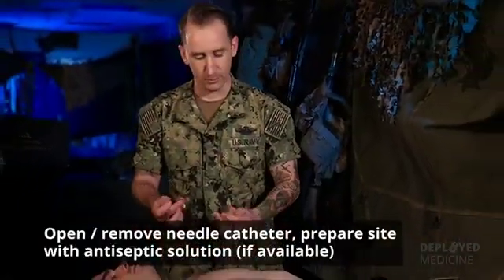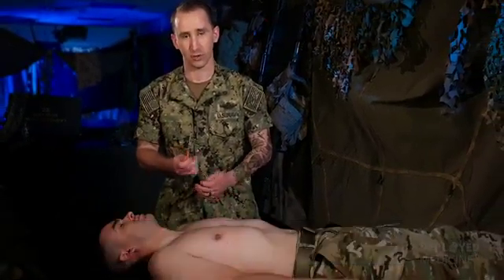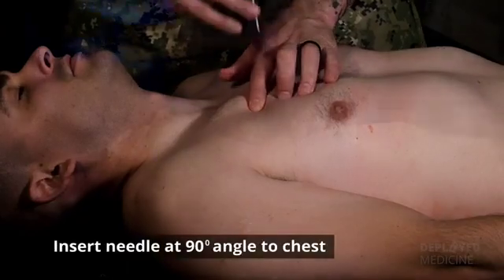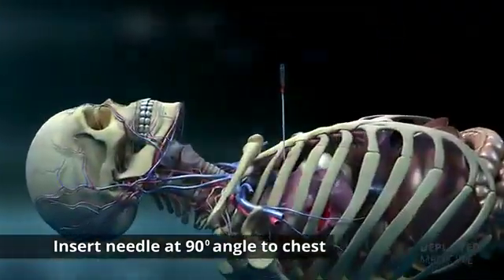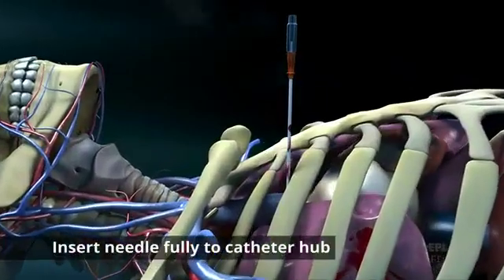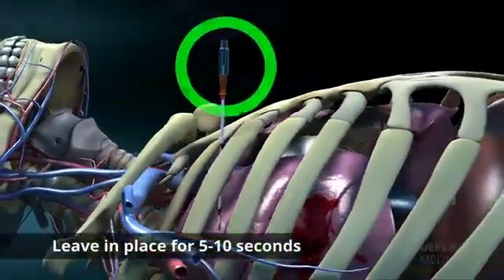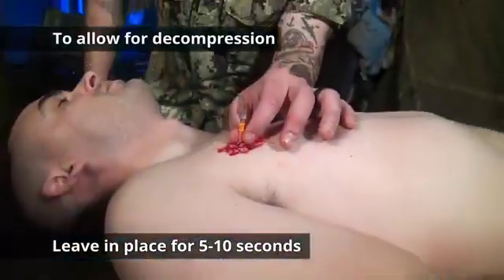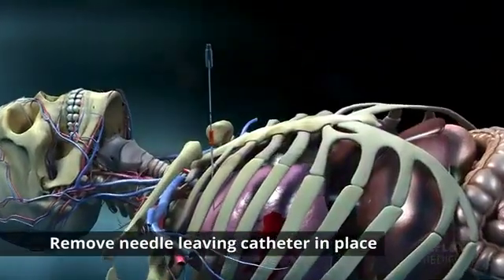Once I've identified my site, I'm going to remove the needle catheter — remember, it's 14 or 10 gauge, three and a quarter inch. I have my site identified and I'm going to insert this at a 90 degree angle, perpendicular to the patient's chest. Insert the needle and catheter fully to the catheter hub and leave in place for five to ten seconds to allow complete decompression to occur. After the decompression has been performed, remove the needle, leaving the catheter in place.